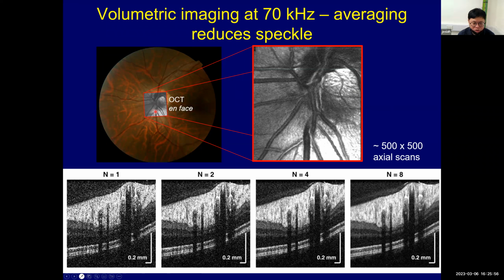But when we use OCT, we can capture the depth information as you can see here, and then you can analyze the layer structure, which is not possible with fundus imaging.